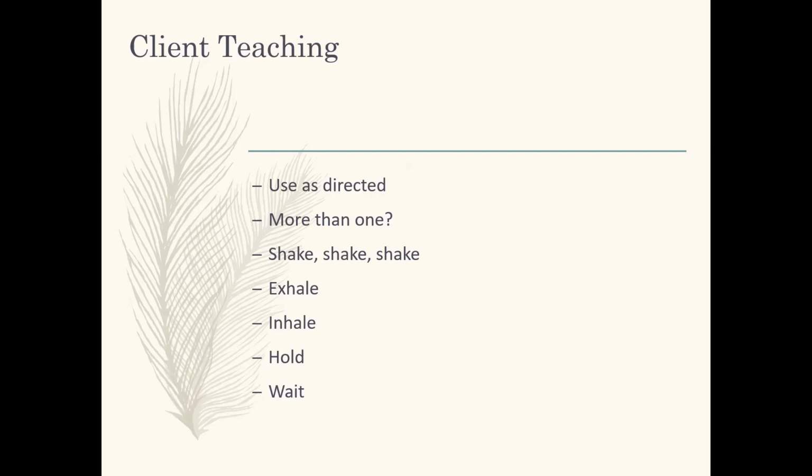All right, shake, shake, shake. They need to make sure they're shaking vigorously 5 to 6 times before using an MDI. So you want to make sure that they're shaking it. That's around 2 to 5 seconds, but they need to shake it really hard 5 or 6 times and make sure that they take their cap off. We want to make sure that we're telling them to exhale outside the inhaler, to put their teeth and their lips around the mouthpiece so their teeth are out of the way, and to inhale slowly and deeply while pushing down or administering the medication.